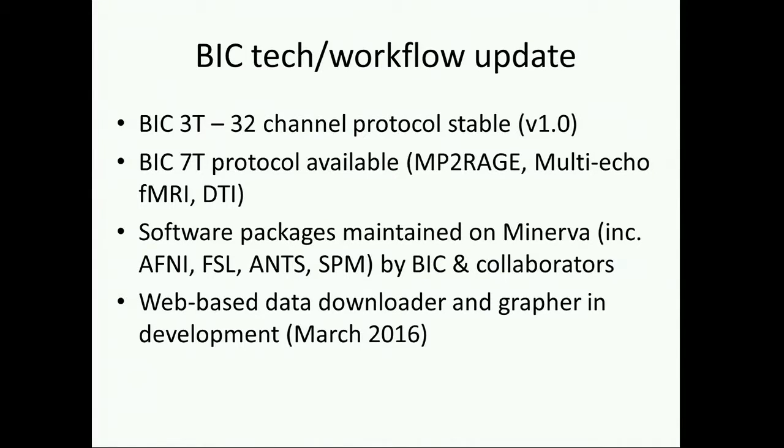A lot of that bug testing has been done on the data acquired with the NARC protocol, which is going on 200-300 subjects at least, over 1,000 scans, so we've really beaten these sequences down. So it's not a bad time to consider migrating. If you haven't migrated to BIC sequences already, now's a good time to consider it because they're quite well tested.